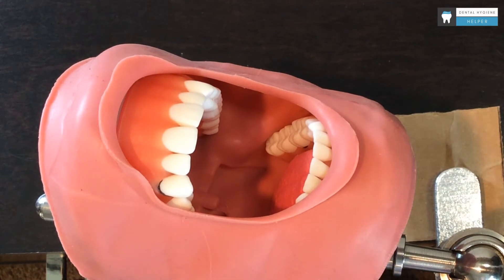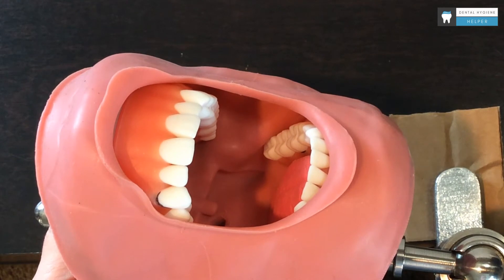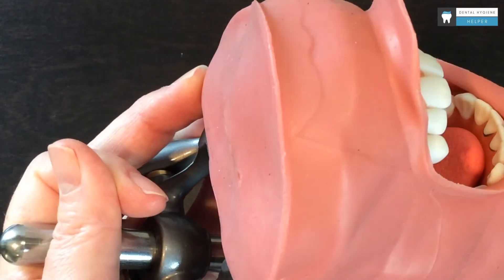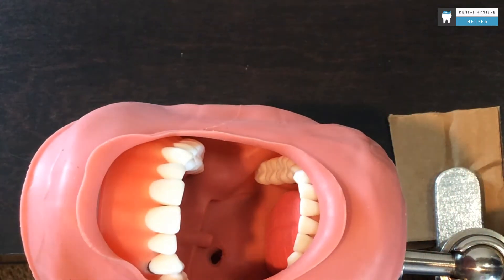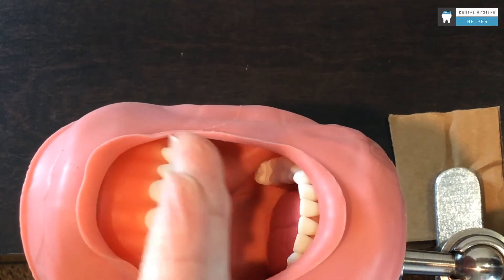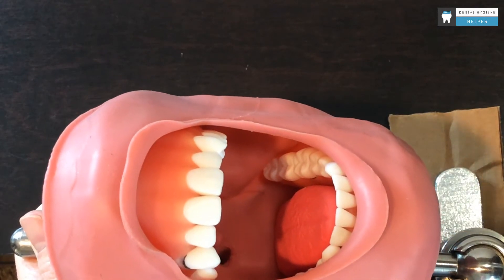Let's look at the lower arch now. Because we are working on the lower, we are going to tilt our patient up slightly. I sometimes see students with the patient really tilted up — they do not need to be sitting up, it's just a slight tilt. If you think of your maxillary as having the occlusal of the maxillary perpendicular to the floor, it's just a little bit of a tip up.